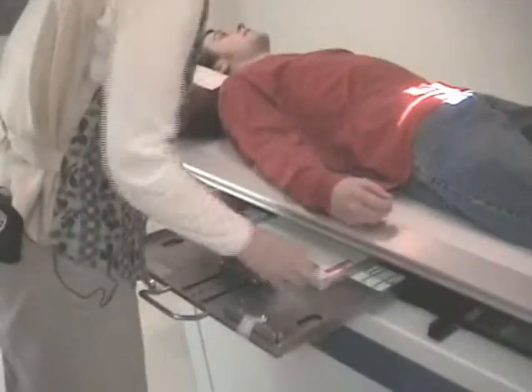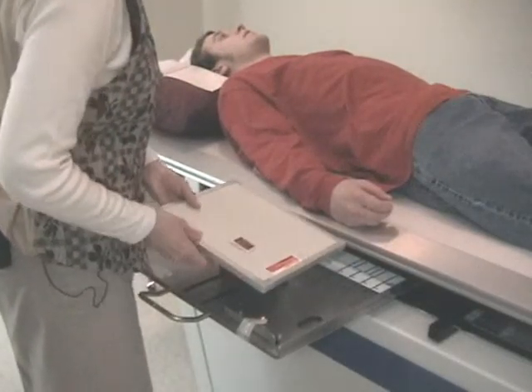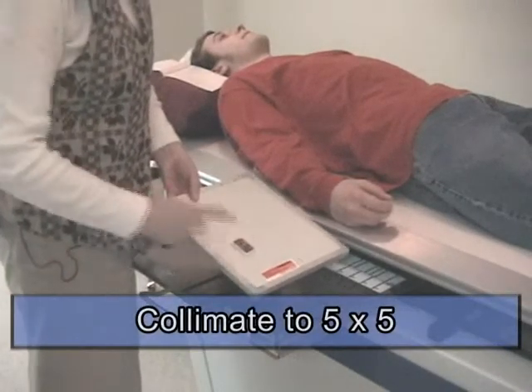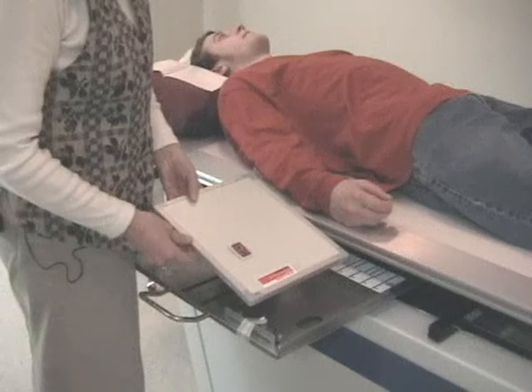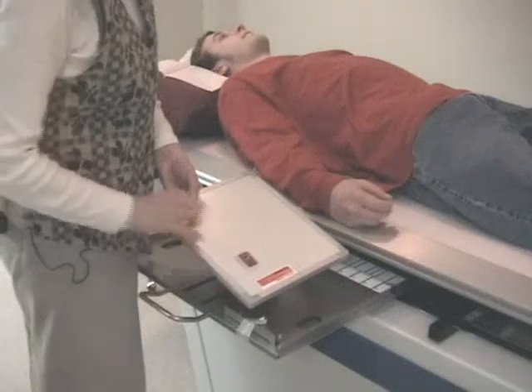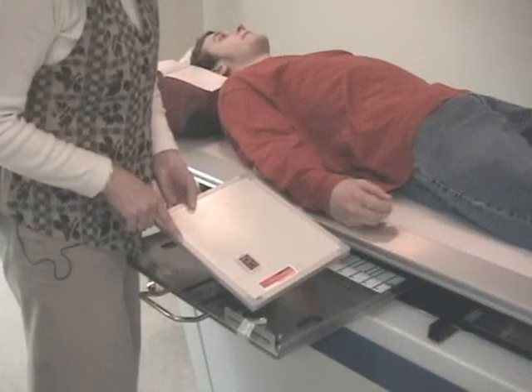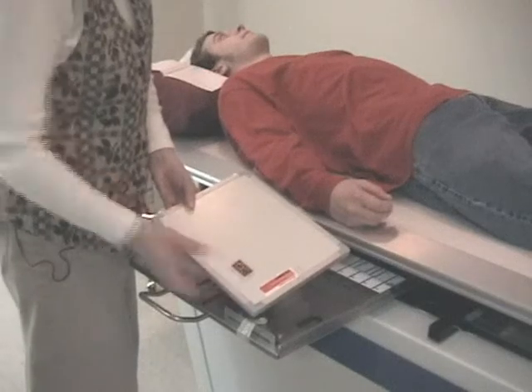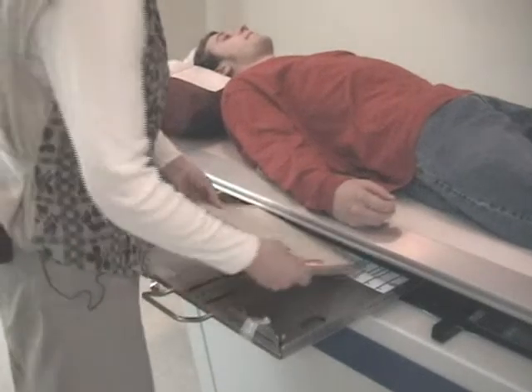Change film, new cassette. Now, the coccyx is only the size of a postage stamp. So you're going to collimate to a 5x5. The cassette is 10 inches, and you're going to have 5 inches, so 5 from 10 left you 5, divided by 2 edges is 2.5 inches up. So this marker, bring it in about 2.5 inches up. Side to side it will be 5 inches. This is 8. So 5 from 8 is 3, divided by 2 sides of the cassette, move that marker in 1.5 inches. That's the process to calculate how and where to put your marker.